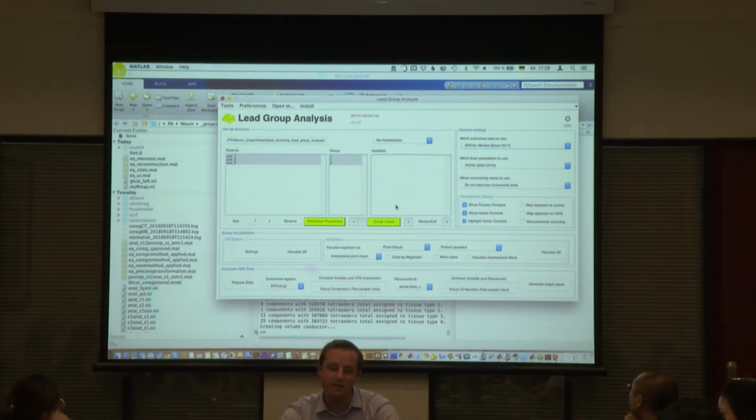One other limitation here is that I think, at least for most functions, it only works for bilateral DBS electrodes. So we have big problems with unilateral or more than 2 electrodes. And I think for some functions it will also only work for the 4 contact leads, and not the 8 contact leads.